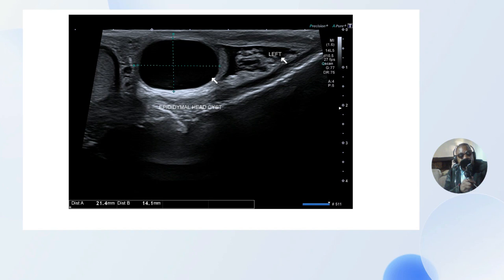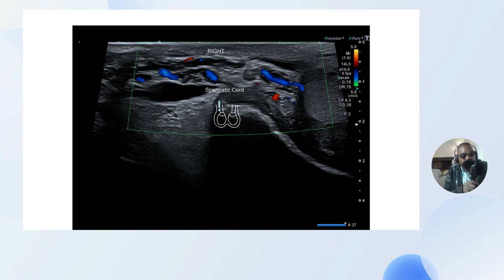I made a measurement of the cyst, and you can see the area around it — there are no other lesions or masses visible. I also made an effort to demonstrate the surrounding structures. What we have here is the inguinal canal, and you can see the spermatic cord. On color Doppler you can see perfusion in the spermatic cord, and I followed it all the way — there was no other abnormality.